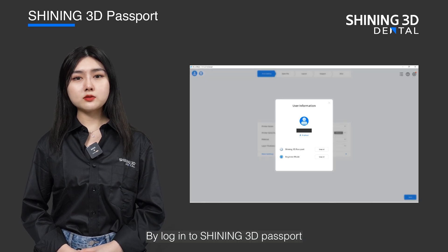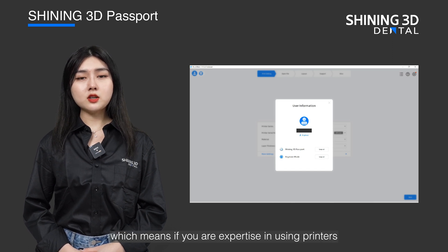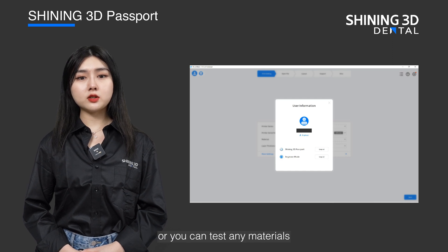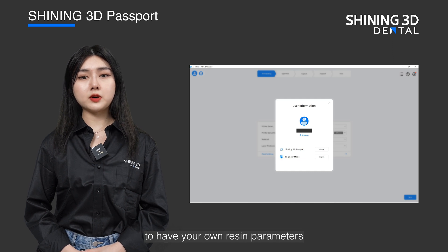By logging into Shining's 3D passport you can enter the engineer mode, which means if you are an expert in using printers, you can adjust the resin parameters or you can test any materials that Shining hasn't validated yet to have your own resin parameters.